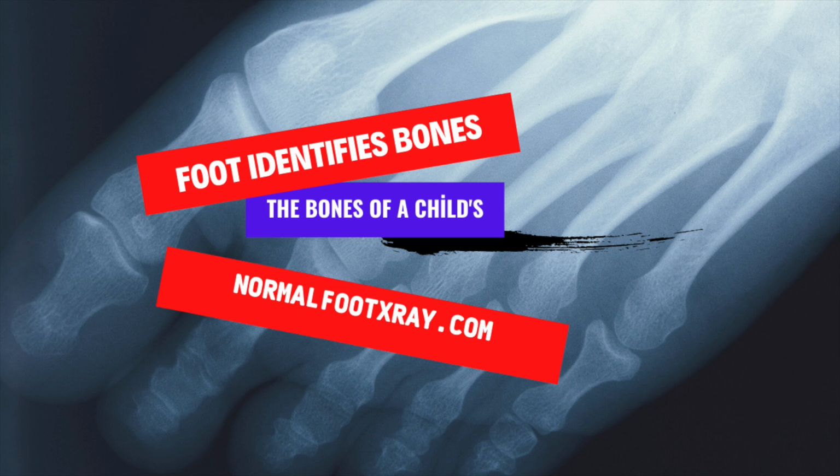They are more easily damaged by a sprain than by a broken bone, which can take months or even years to heal. An X-ray of a child's foot will show the development of these bones, allowing your doctor to diagnose any problems early. An X-ray of the foot can help your doctor diagnose many common symptoms in children. It can help determine if a child has broken bones or dislocated joints, as well as assess the proper alignment of bones. It can also help plan surgery and evaluate the outcome.